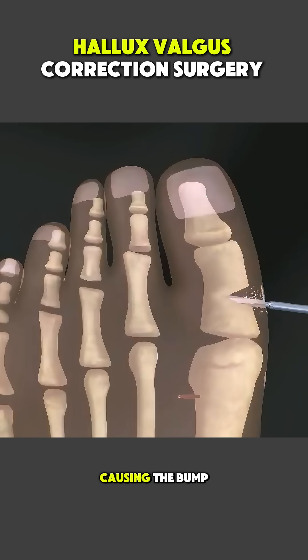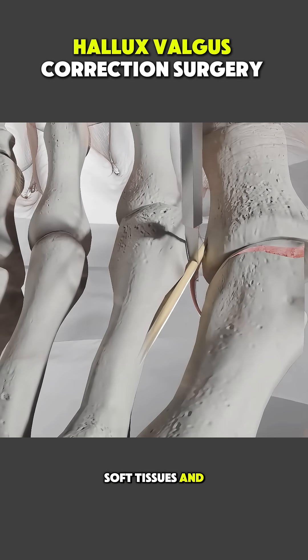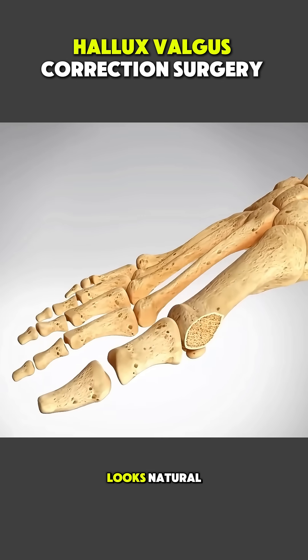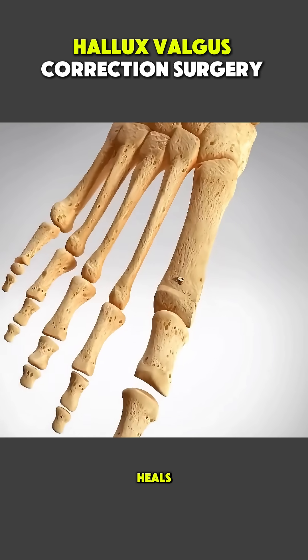Any excess bone causing the bump is shaved away, and the surrounding soft tissues and ligaments are balanced so the toe stays in its corrected position. Once the alignment looks natural, the bone is secured using small screws or pins to hold everything stable while it heals.